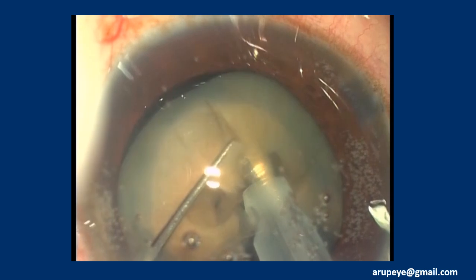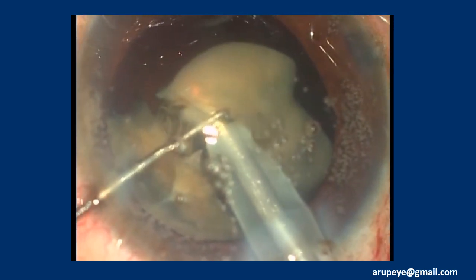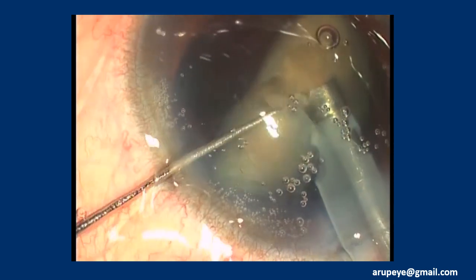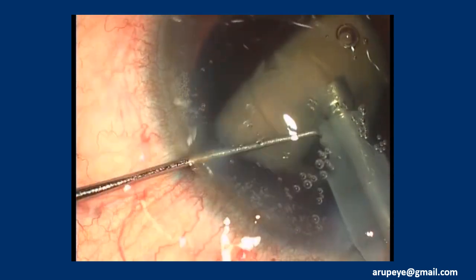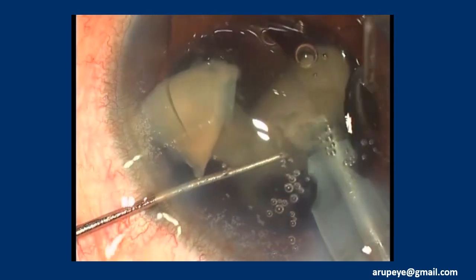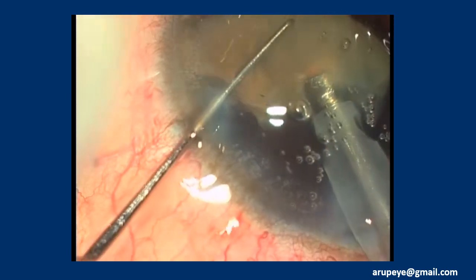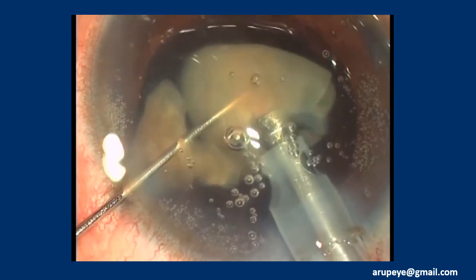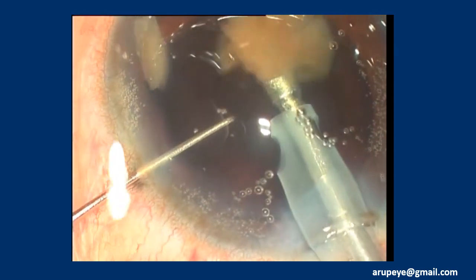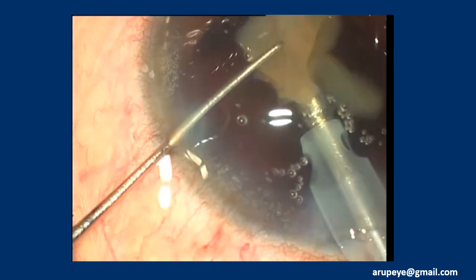Post-occlusion surge has additional perils in Morgagnian cataracts and ought to be avoided. The freely mobile nucleus and its components have a tendency to float anteriorly, and adequate attention has to be paid to the corneal endothelium. I prefer to top up the anterior chamber with repeated injections of a dispersive OVD. Dispersive OVD is also injected into the capsular fornices in view of the potential zonular weakness and the need to splint the capsular bag.